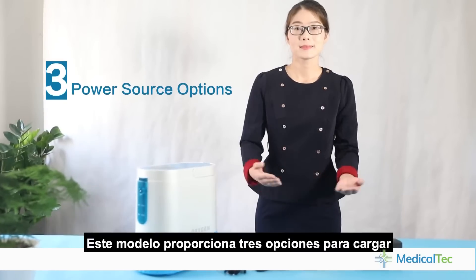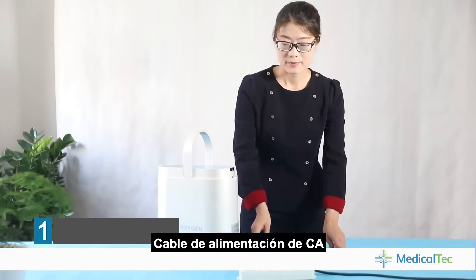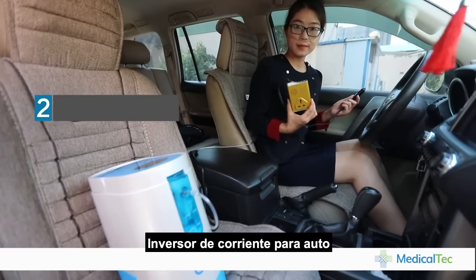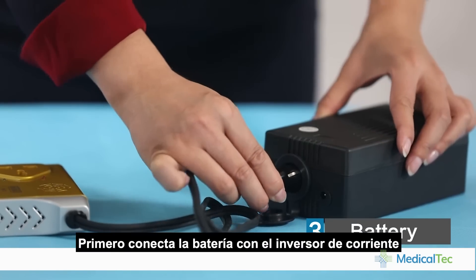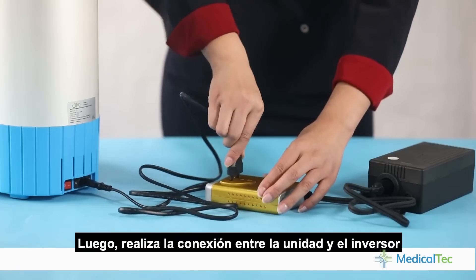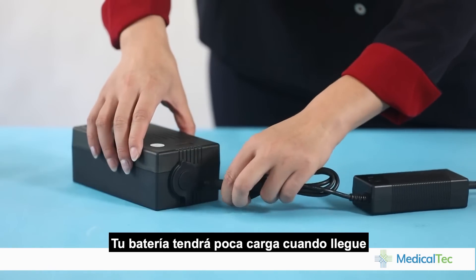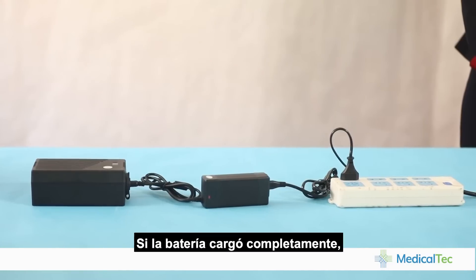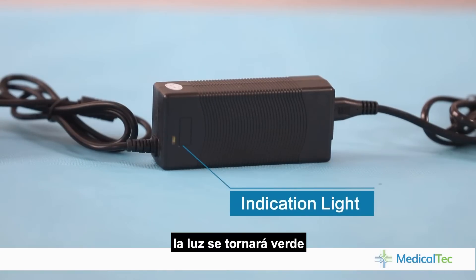This portable concentrator provides you with three power source options. AC power — plug in to use directly. Car inverter — connect with your car cigarette lighter. Battery — connect with the car inverter first, then connect the unit with the car inverter. The battery will have little power when it arrives, so please charge it completely before operation. When the battery is fully charged, the indicator light will be green.